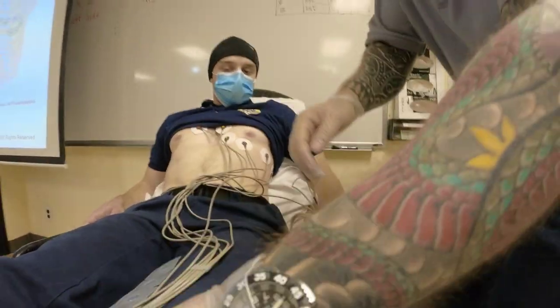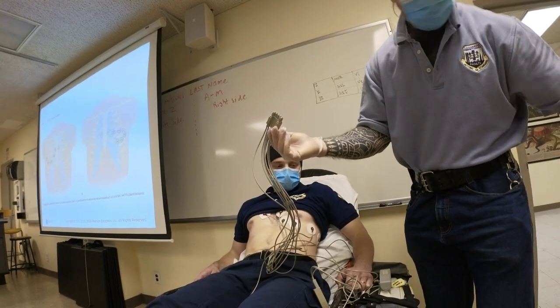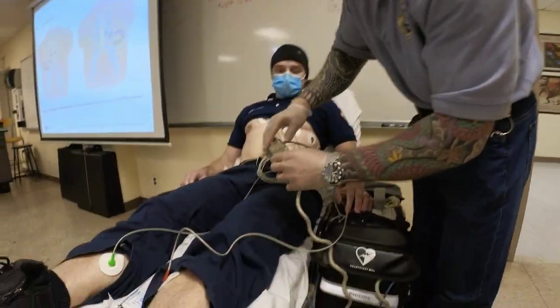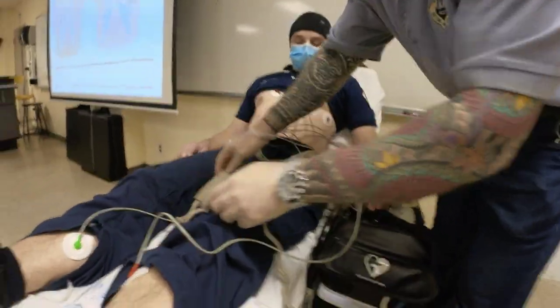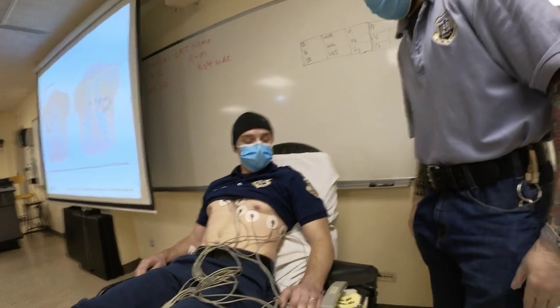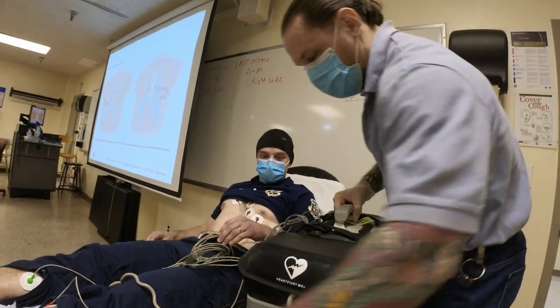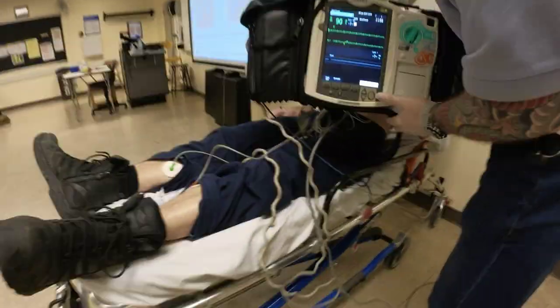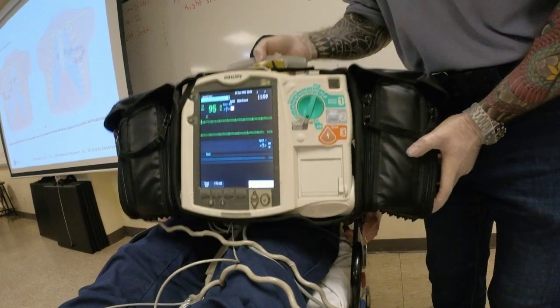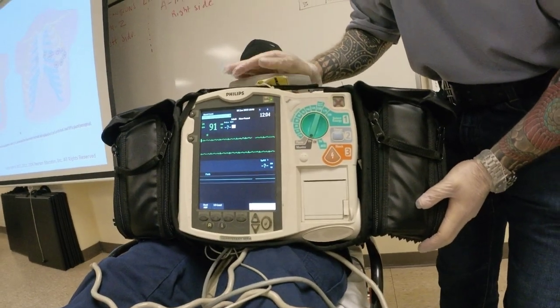All right, good. Another thing, if you are not getting a reading, you forgot to connect these. You see how they snap on? Now everything is connected, right? You could ask your patient his age. So, sir, how old are you? 27. All right. I'm going to do something that I would not do on a normal person. I would put this on your lap for now just to show you guys the buttons. On a patient, I would do it on here, but put one hand here. All right.